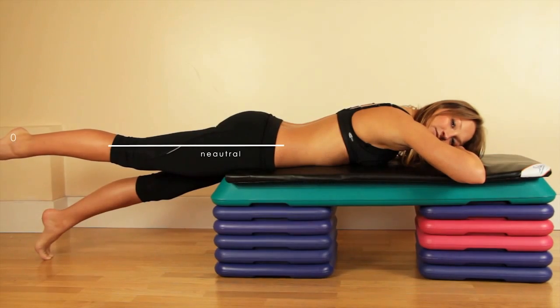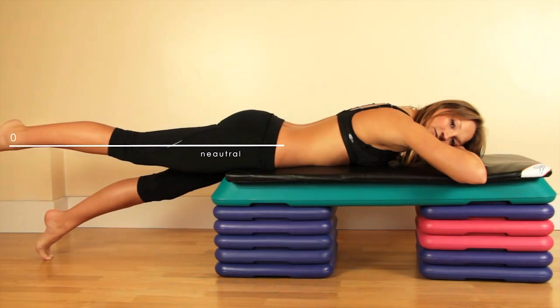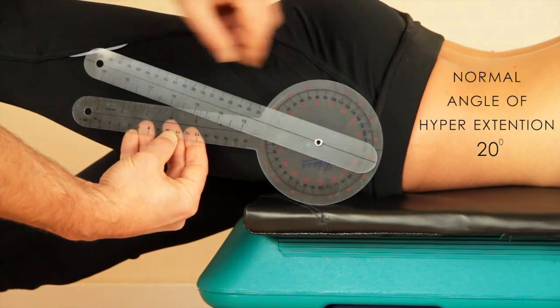Hyperextension of the hip is measured from the neutral line backwards. Again, use the hip joint as a reference. Normal hyperextension is around 20 degrees.